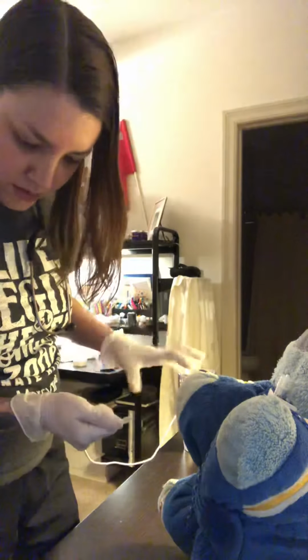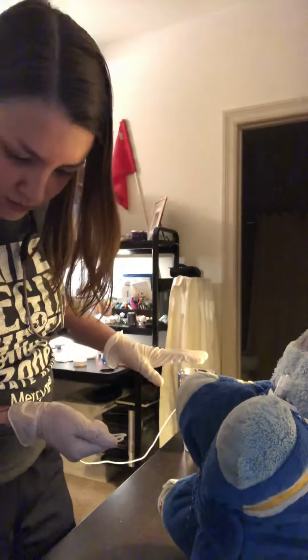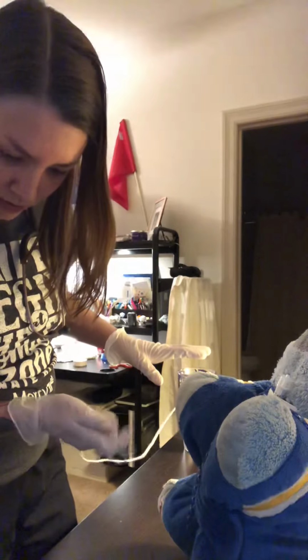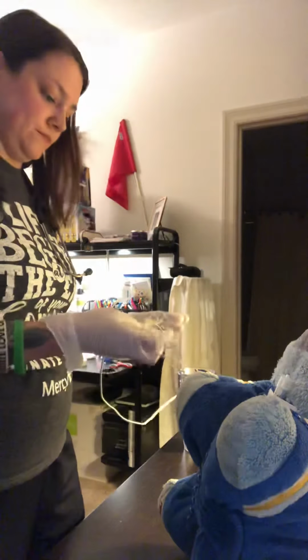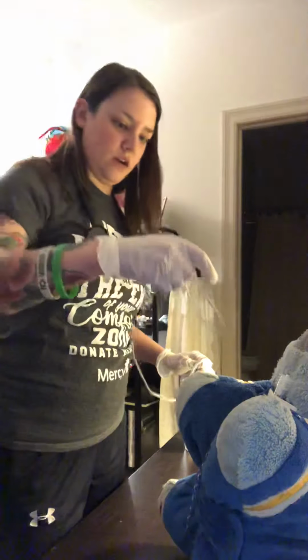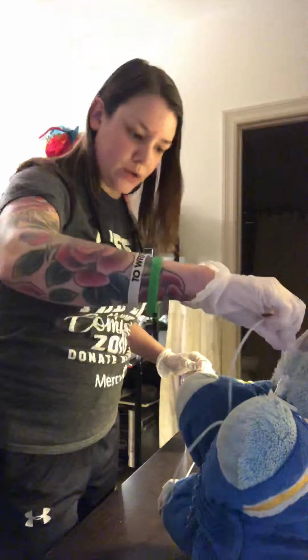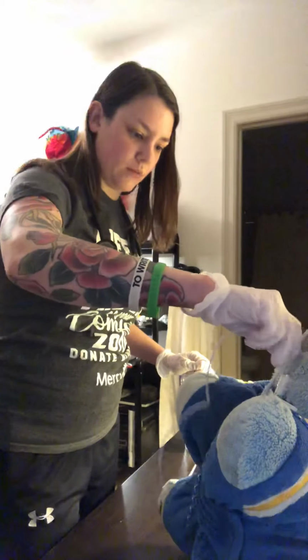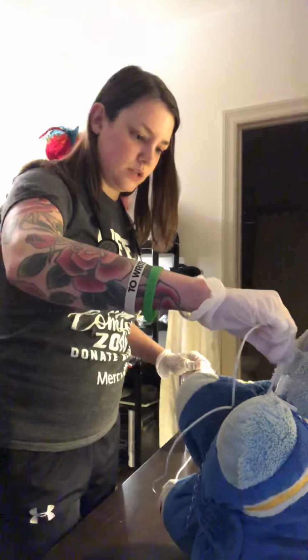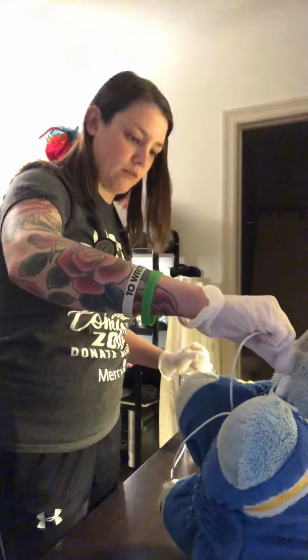I keep touching this, so I already contaminated this hand, so I would not be touching this. The dominant hand inserts the catheter into the trach, so I can hold it over here. So I'd bring it up. It says here I would put resistance, but in the video it said I would not. So I'll just stick it in there, and I would not be having the suction on, so the suction would be off right now while it's in.